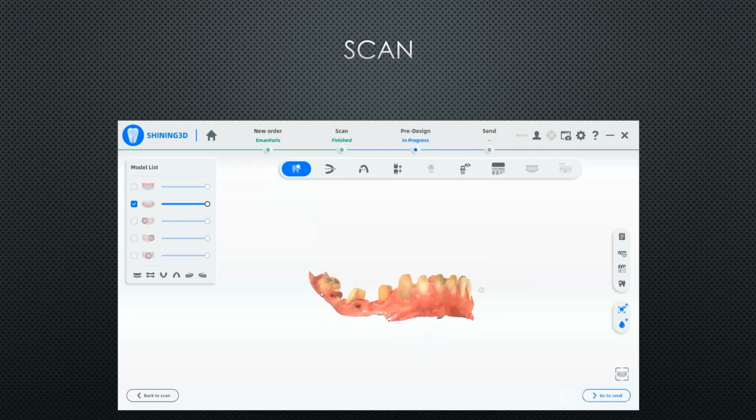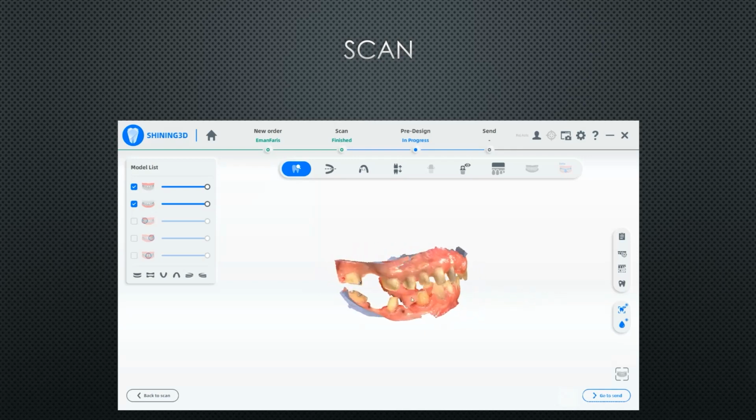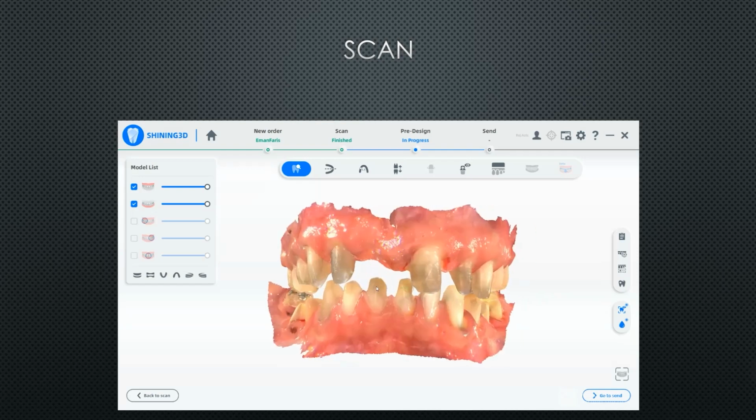Your preparation depends on the space of your bridge. How long is it? There are a lot of things interfering with your preparation and the way you prepare your teeth. So in this case, I couldn't prepare more because I want to conserve the teeth. I don't want to reduce the preparation more for the sake of modifying my curve of Spee.